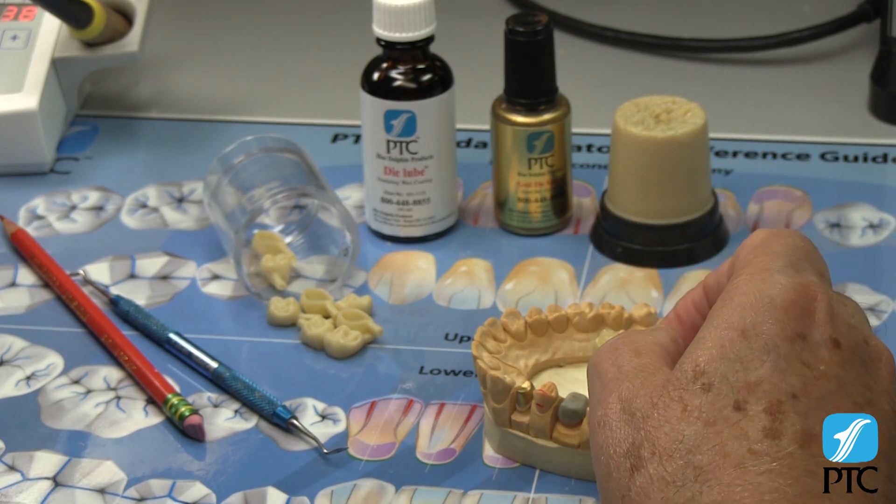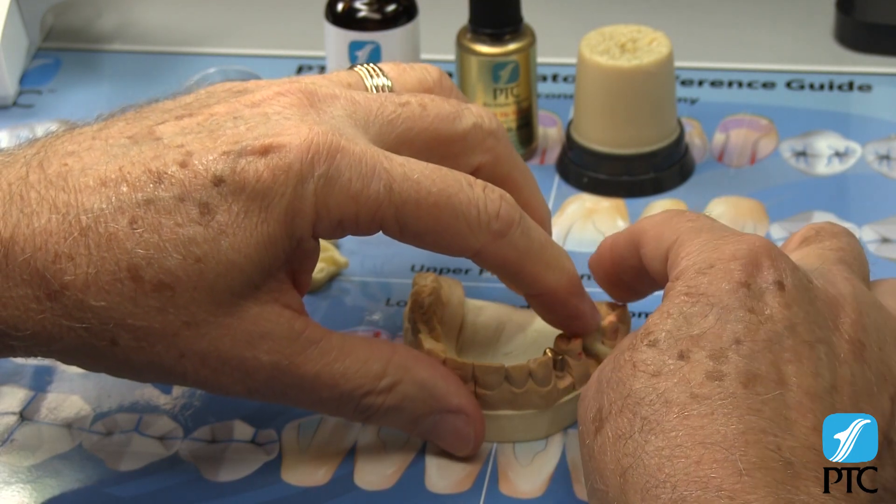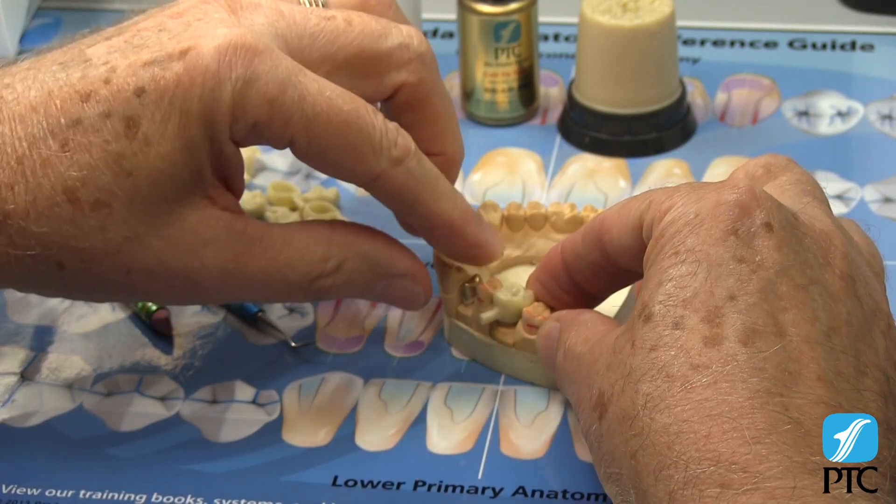Position the wax form over the coping on the model and press it firmly to place. Then close the articulator or press the models firmly together. The anatomy of the crown will not distort.